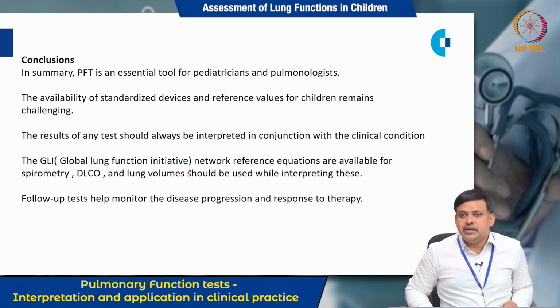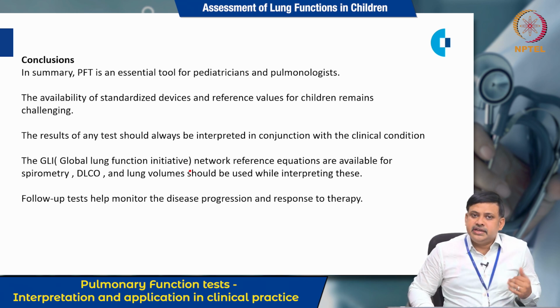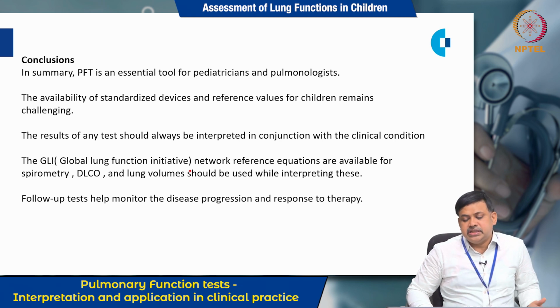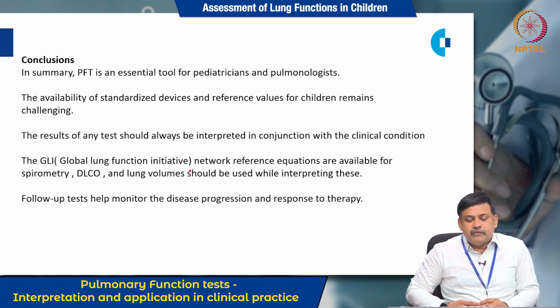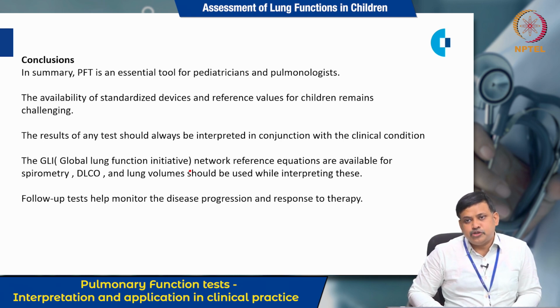Initially GINA was followed, but it has changed to GLI, which is the Global Lung Function Initiative Network. Reference equations are available for spirometry, DLCO and lung volumes that should be used while interpreting these conditions. Follow-up tests help monitor the disease progression and response to therapy.